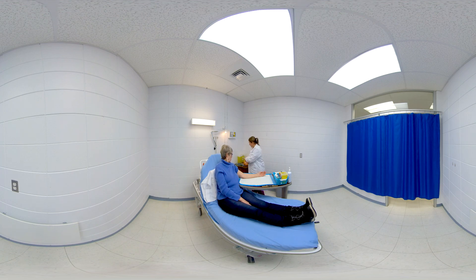She then washes her hands with a hydro-alcoholic solution and puts on a pair of non-sterile gloves of the right size.